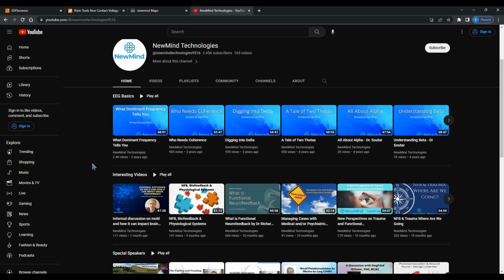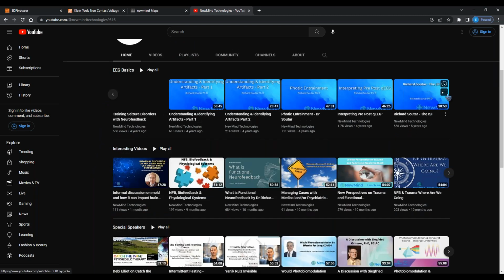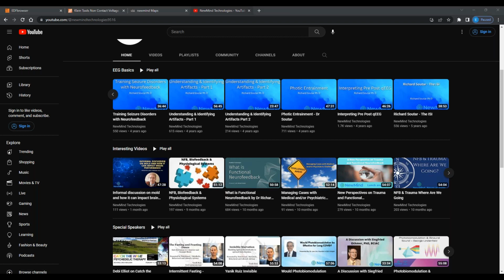But if you do download this, go to the help section. They've got an online manual, and they'll spell everything out for you on how to do it, what it does, and how that's going to affect your signals. So definitely look into that.